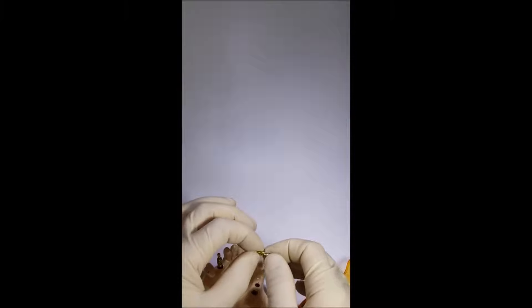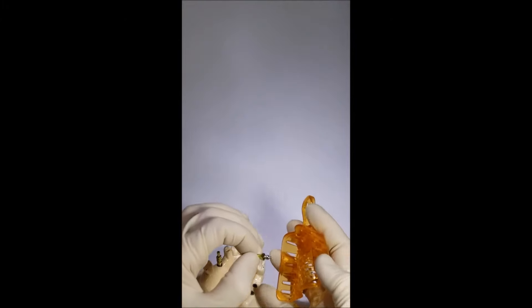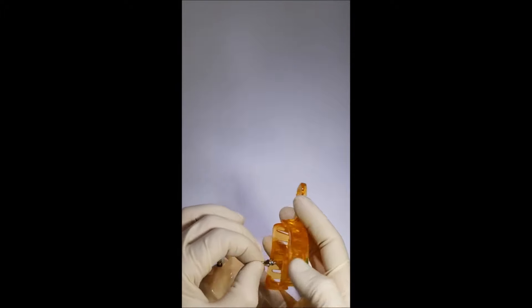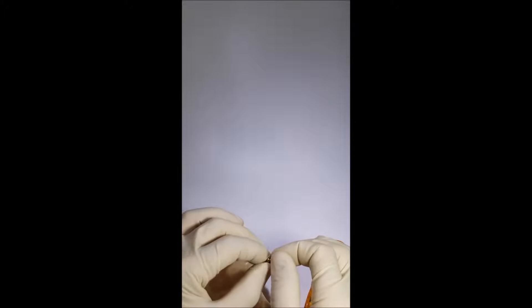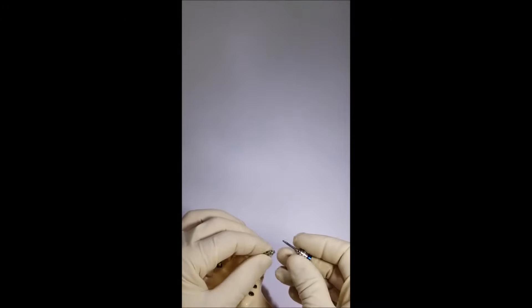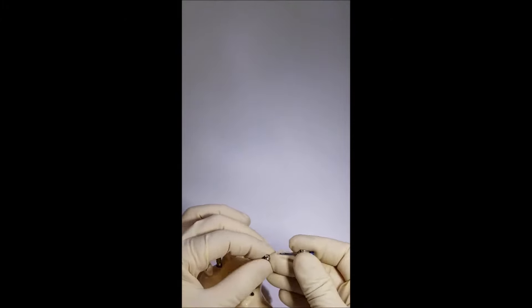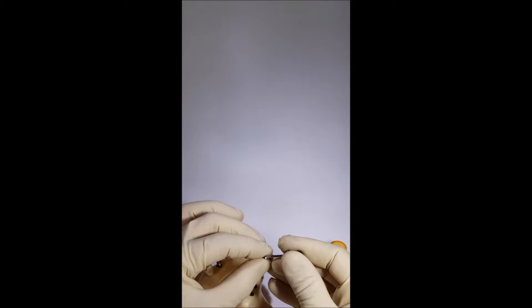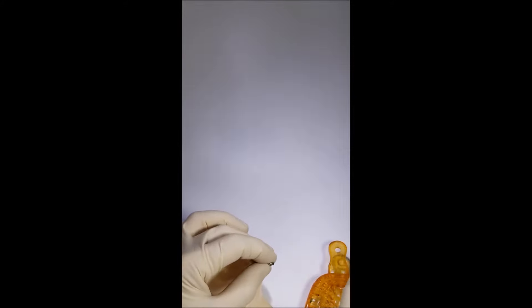Another disadvantage occurs when two implants are located too close to each other, or in cases of convergence or divergence of implants. In these situations, it is very difficult to take impressions using either the open tray or the closed tray impression technique. The transfer has a sufficient height, and sometimes it is hard or absolutely impossible to install it without preliminary cutting.